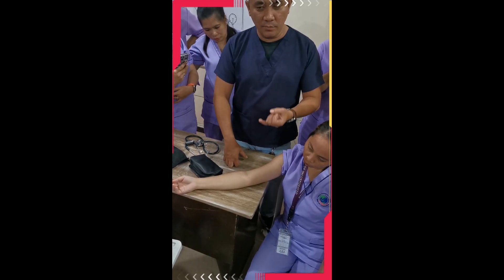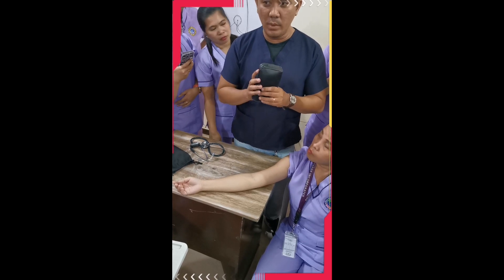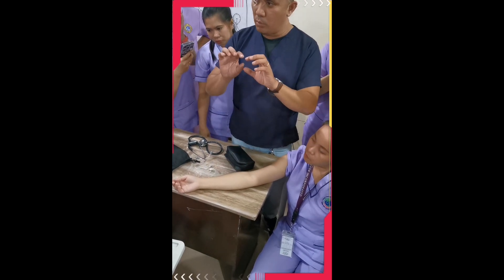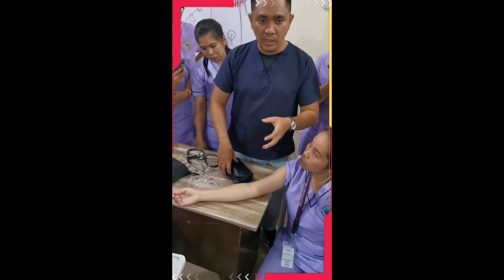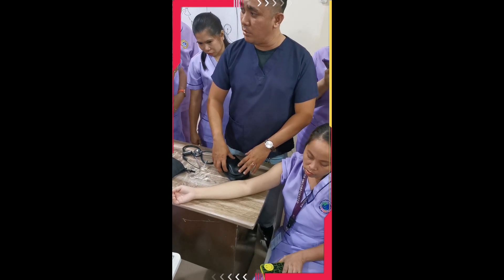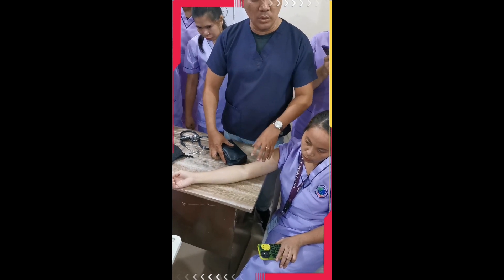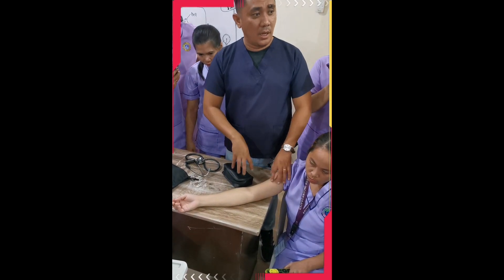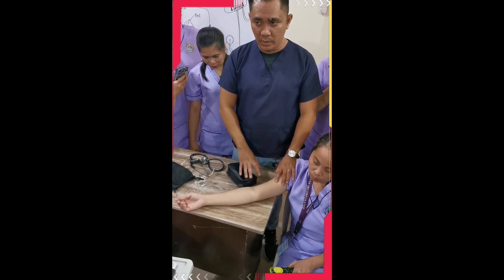You have to determine whether infant, child, or adult because the size of the sphygmomanometer will also affect the reading. So if you have a newborn, you need a newborn-size sphygmomanometer. If you have a child, use the child-size. If you have an adult, use the adult-size BP cuff. Do not use the wrong BP cuff size on any patient — determine that first.